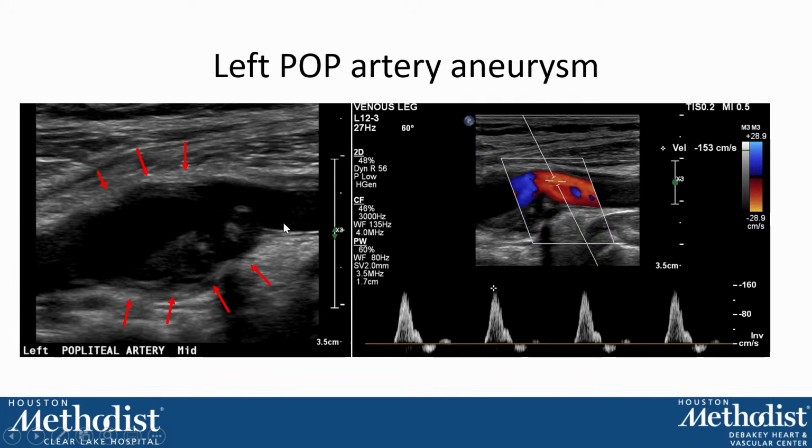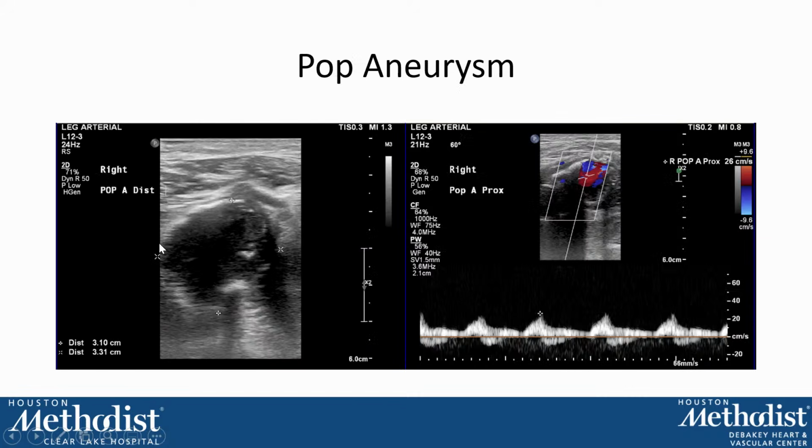This is a patient with a popliteal artery aneurysm. In this case, it's a little smaller than the other. You see the wall, and you see some of the intraluminal thrombus or intimal lining, gelatinous material, etc. Again, you see a popliteal aneurysm, slightly irregular, calcified wall, okay?